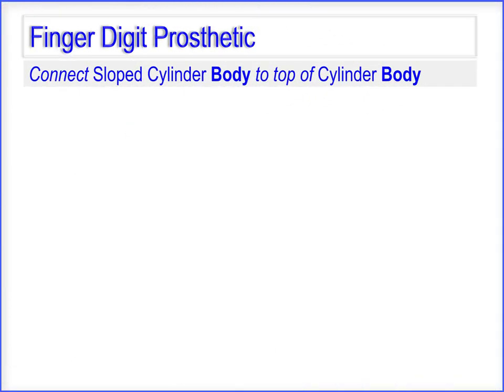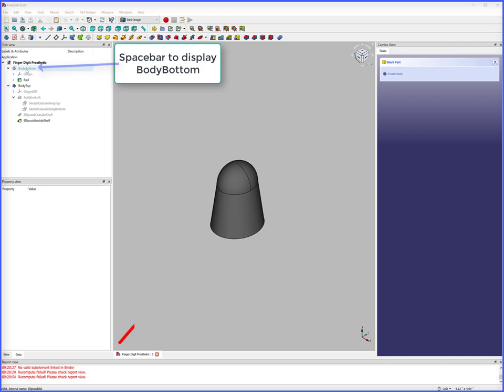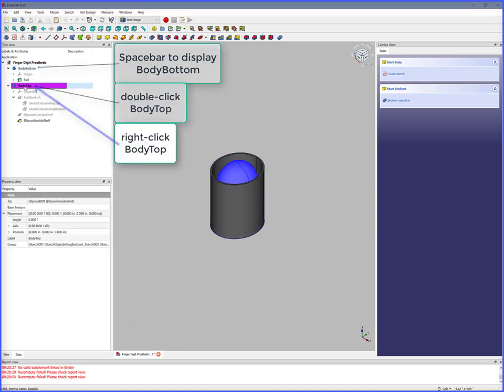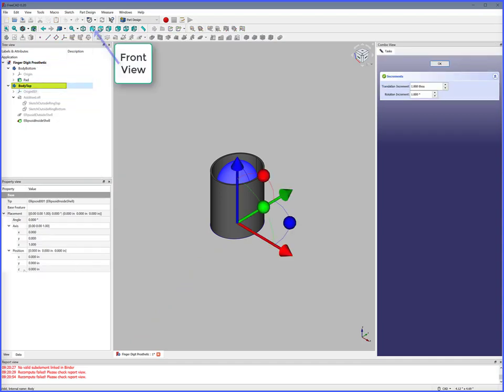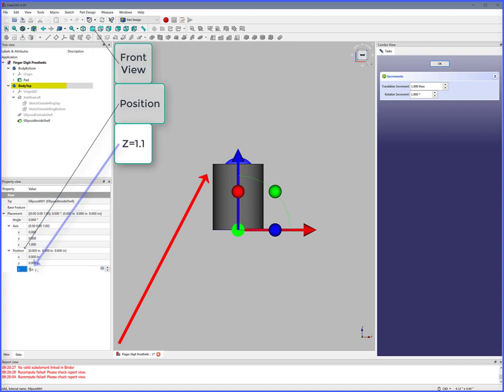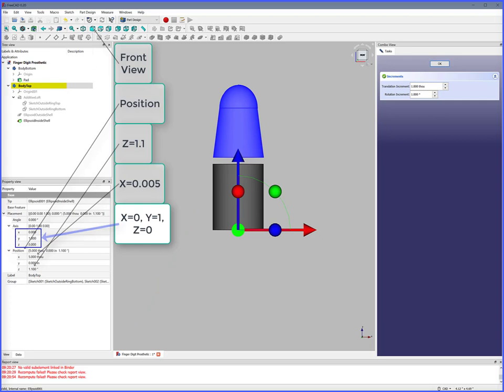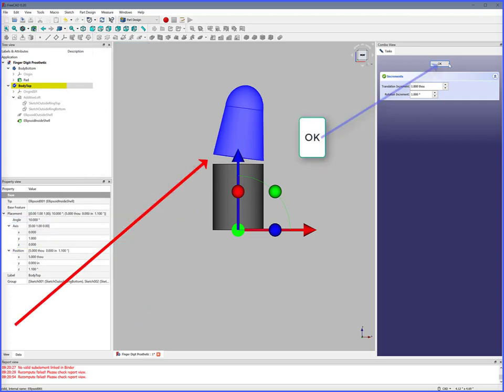Next, connect the sloped cylinder body to the top of the cylinder body. Hit spacebar to display Body Bottom, double click Body Top, right click Body Top, Transform, Front View. Position: Z is 1.1, X is 0.005. Axes: X is 0, Y is 1, Z is 0, Angle is 10 degrees. OK.